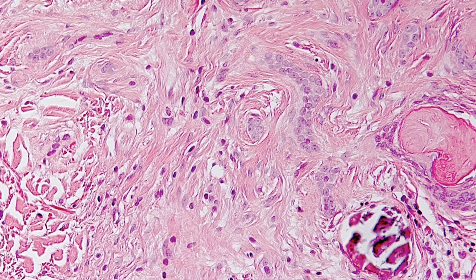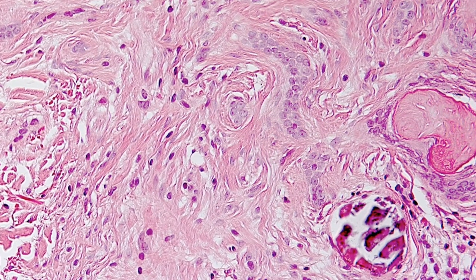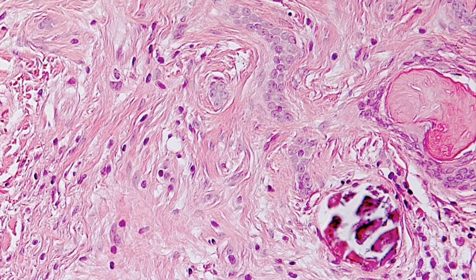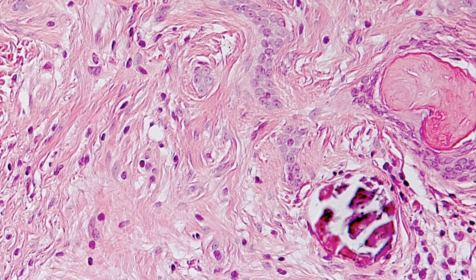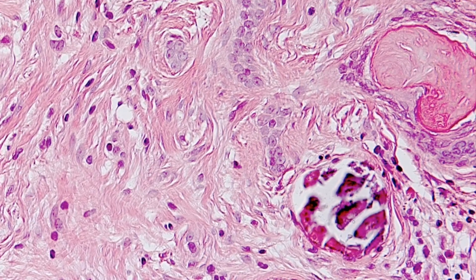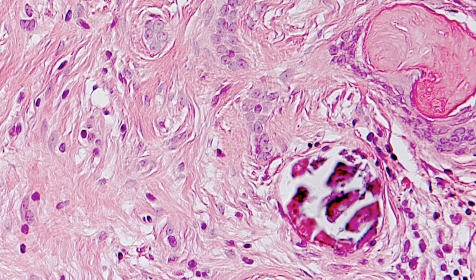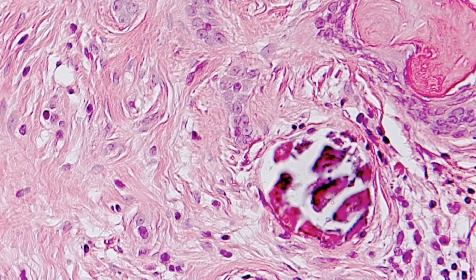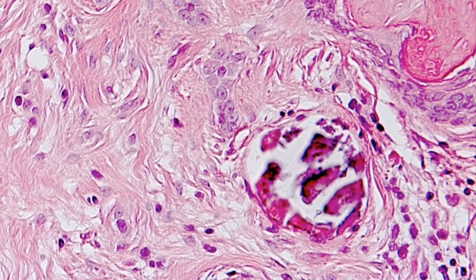In summary, histologically, desmoplastic trichoepitheliomas are composed of strands of rather bland basaloid cells 1 to 3 layers thick, with the presence of horn cysts, some of which may calcify. And the stroma is desmoplastic.